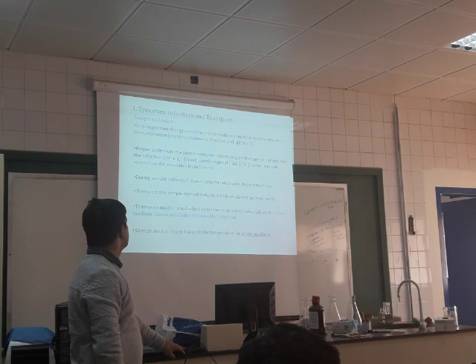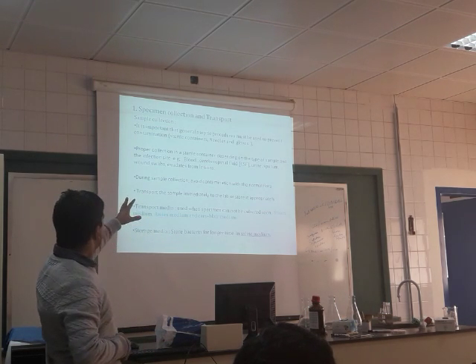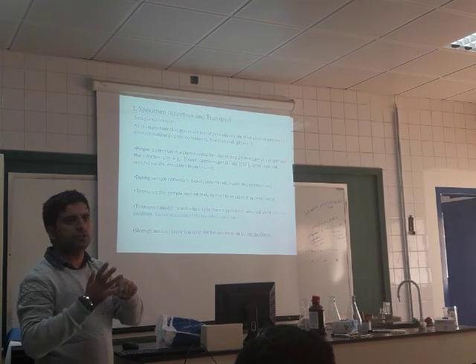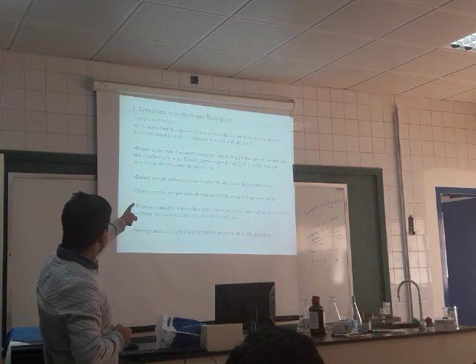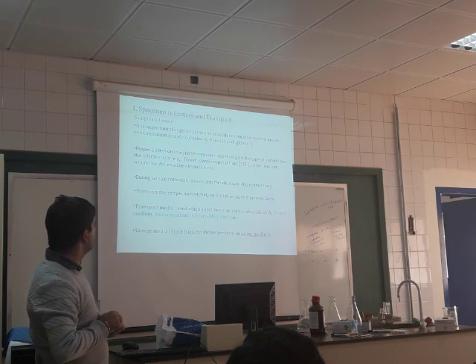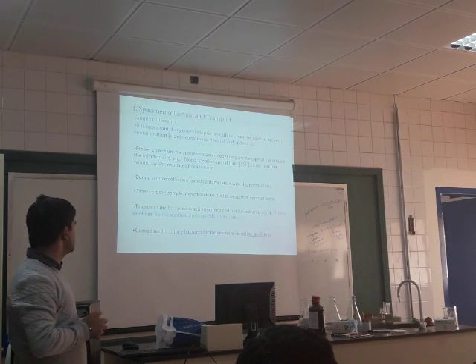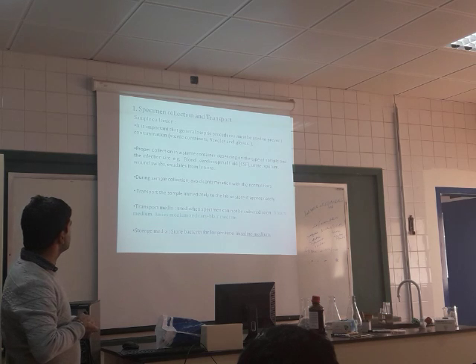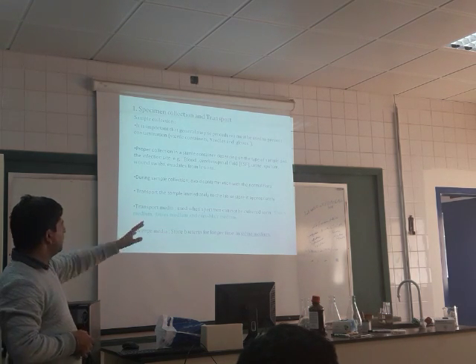So let us see now. Sample collection, as I told you, it's important to use aseptic methods. You need gloves and a needle for the sample collection. A sample could be blood, cerebrospinal fluid, urine, a wound swab, or exudates from lesions. During sample collection, always avoid contamination by normal flora. Transport the sample immediately to the laboratory.